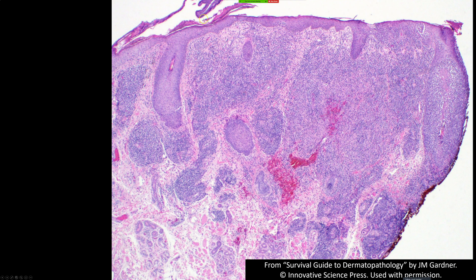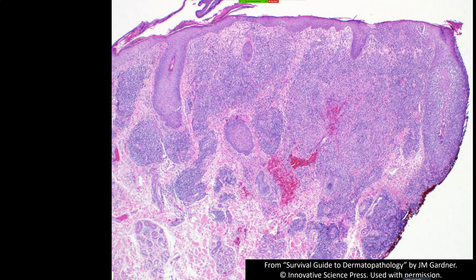Here's a case showing variation — dense infiltrate in the dermis, plus infiltration around eccrine coils, a Pautrier micro-abscess, and look at this hair follicle: it's completely expanded by lymphocytes, with what looks like Pautrier micro-abscesses and tagging in the follicular epithelium. This is called folliculotropic mycosis fungoides. Some patients have involvement only in the follicles without epidermal involvement; sometimes you have both as in this case. This form can be harder to treat and may have a more aggressive clinical course — partly because it's deeper, so topical treatments have difficulty reaching the follicles.